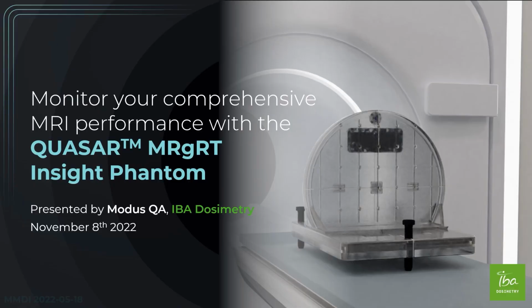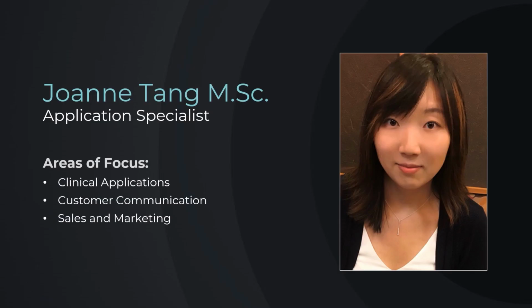Thank you everyone for attending this webinar on monitoring your comprehensive MRI performance with the QUASAR MRgRT Insight Phantom. And just so you have a face to put towards this embodied voice, I'm Joanne and I'm the application specialist at Modus QA. Previous to this position, I completed my Master's of Science in Medical Biophysics at the University of Western Ontario, where my focus was mostly on the application of multimodality imaging in neurological and cardiovascular systems. Currently, I'm a bit more focused towards clinical applications, customer communications, as well as the sales and marketing aspects for all the QUASAR products at Modus.